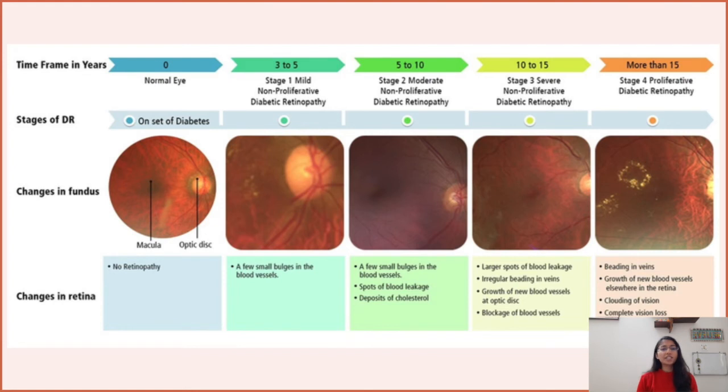The major challenge faced after importing the data is to process it and make it suitable for training. So this includes handling of the missing data, if any, categorical values, textual values, spelling errors, and image processing. To ensure that the machines learn the true features of DR rather than device-specific information, we need to process the acquired fundus images from different sources and change them into a uniform format through the following steps.